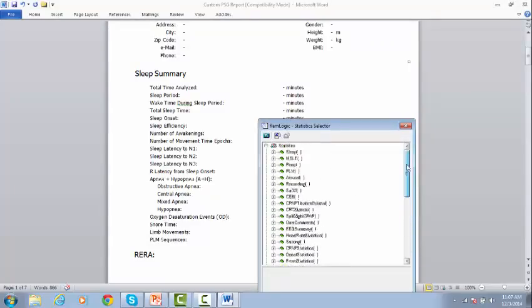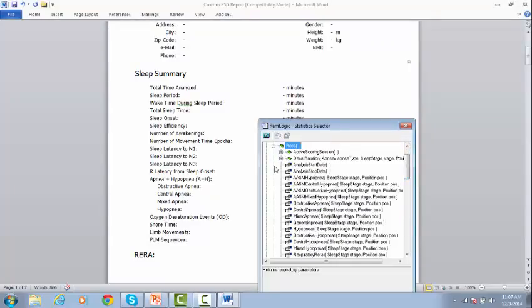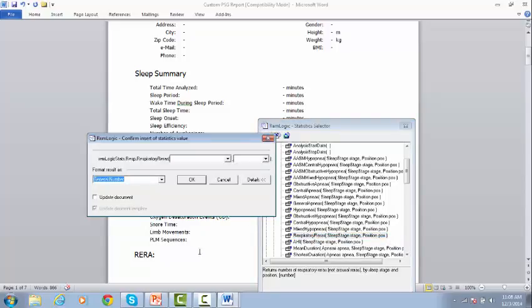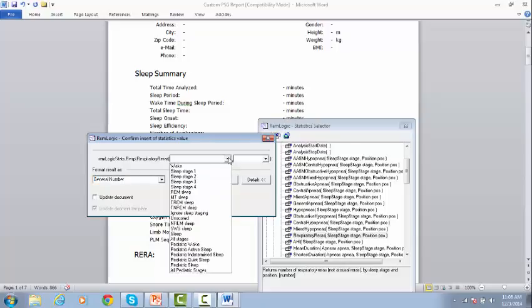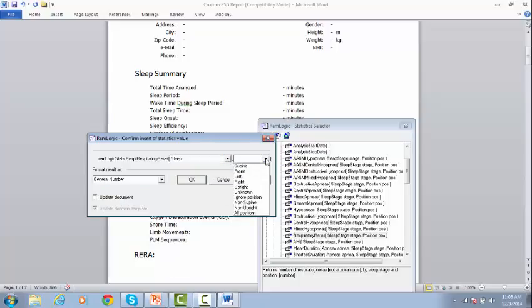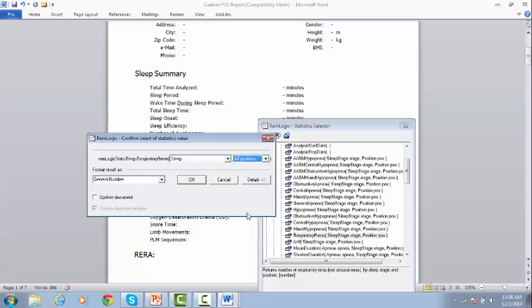Go to the Respiratory, search for the RERA event, right-click on it, and click Insert. The Statistics Value window will pop up. Select the Relations, select Sleep, and in relation to Position, select All Positions, then click OK.